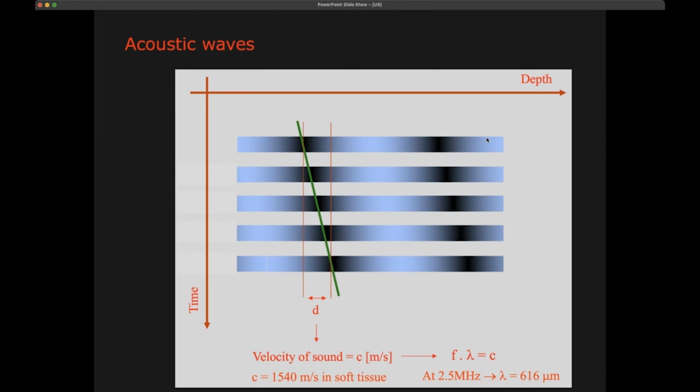And so that's what we say is the wave propagation. The wave propagation also happens with a certain speed. On the one hand, we have the frequency of the wave that we're using, so that's the oscillation of the wave itself, the ultrasound frequency. But on the other hand, this wave will displace with a certain velocity throughout the body, and that's what we call the sound velocity. So that's the displacement of the whole sound wave.